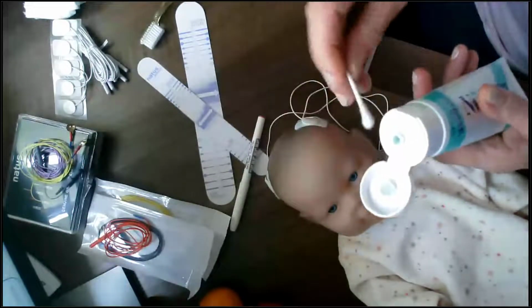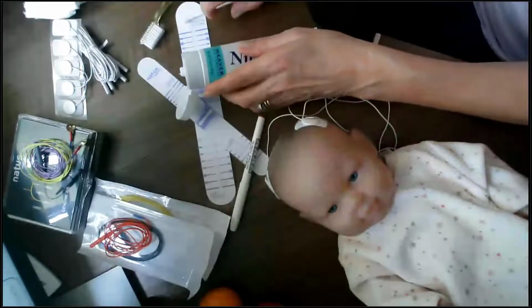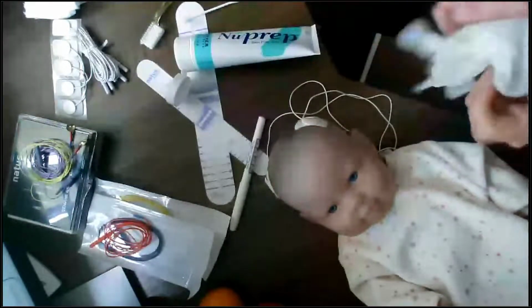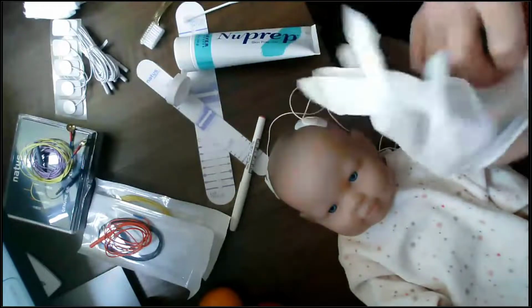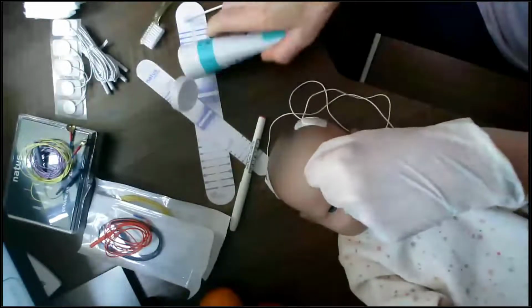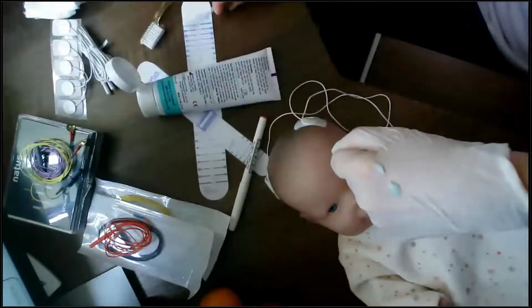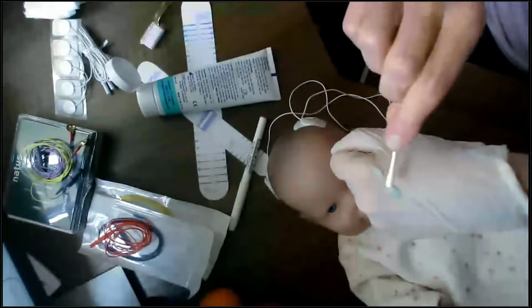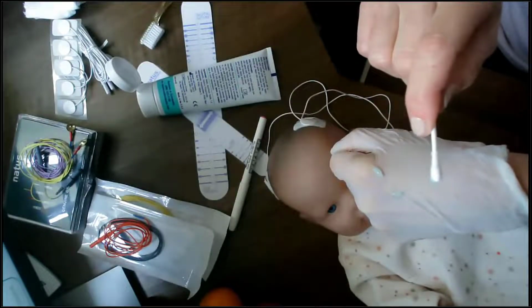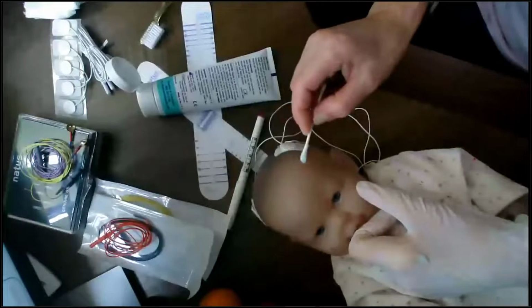Like I mentioned, you can take a small piece of NuPrep on a cotton tip. Another trick, and sometimes this makes it easier in practice, if you've got your gloves on, which you probably will have on, just place a small piece of NuPrep on the back of your gloved hand, and then you can take the NuPrep from there and use it to prepare the baby's skin.